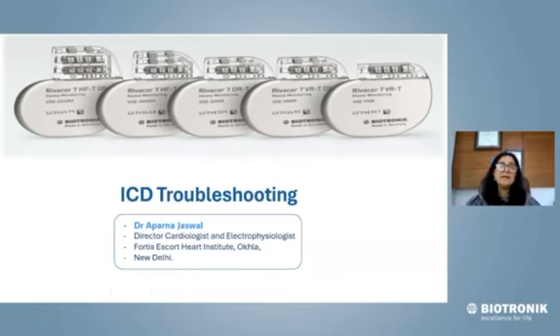So with that, while Siddharth was giving his kind words of introduction to me, I was looking at this screen which read ICD troubleshooting. In the next 45 minutes, I'm going to give you examples, certain cases, and walk you through what it is that we can do. ICD troubleshooting is a very big topic, but in the next few minutes, we will do it.